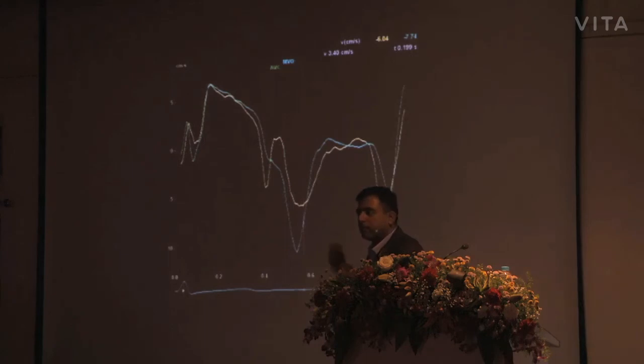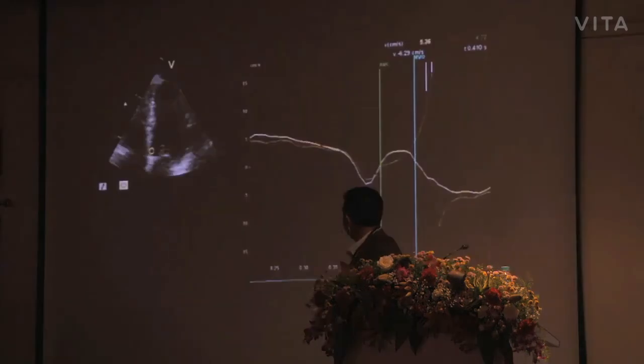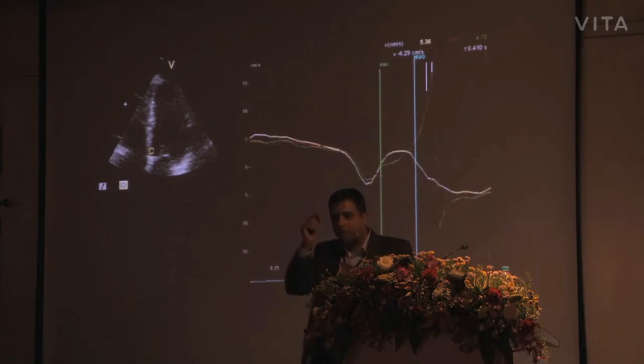Okay. So where does the mitral valve open? That is the question. The opening and closure of the mitral valve are some of the most complex and most debated topics of cardiac mechanics, and everybody has 10 different reasons why the mitral valve closes and opens. Now, how do we find out where the mitral valve opens? We can do that very easily visually. Because we are doing it in the apical views, we can see the valve opening and closing. But we need to pinpoint it exactly.